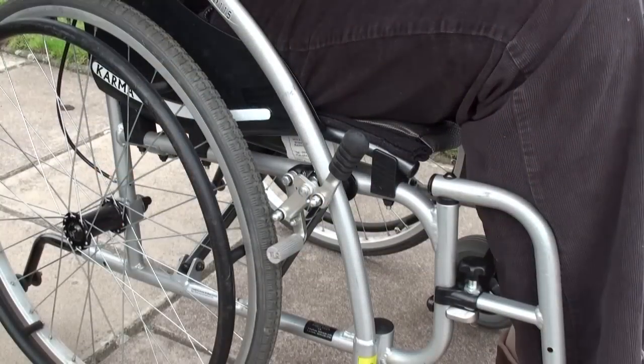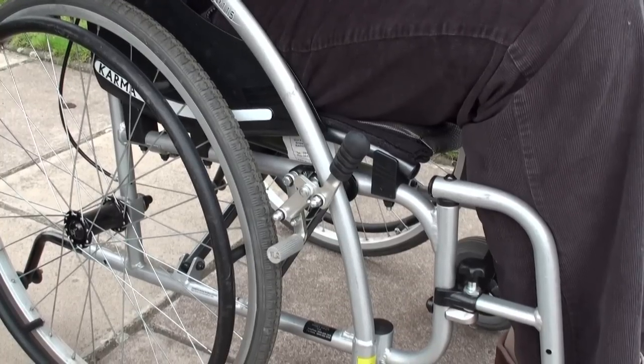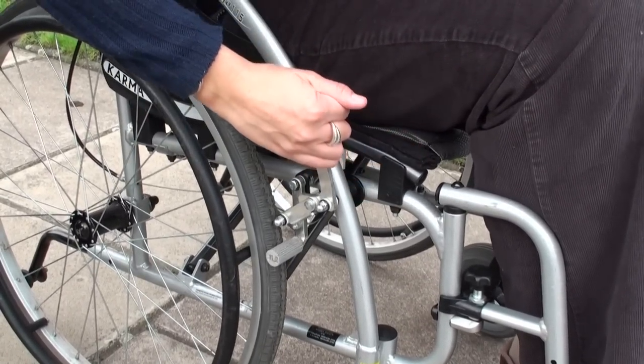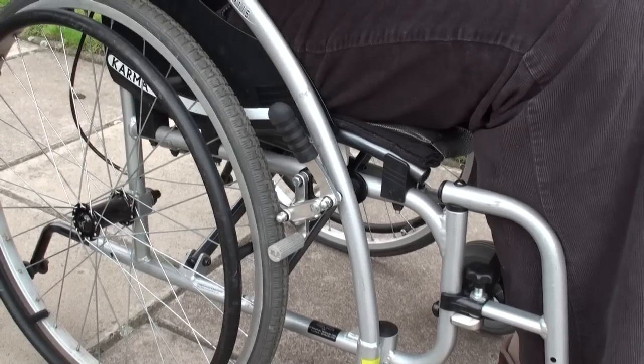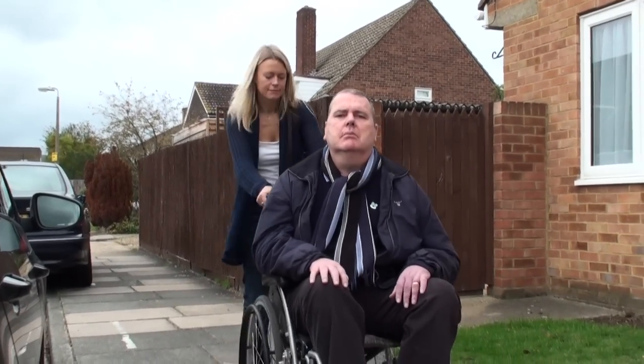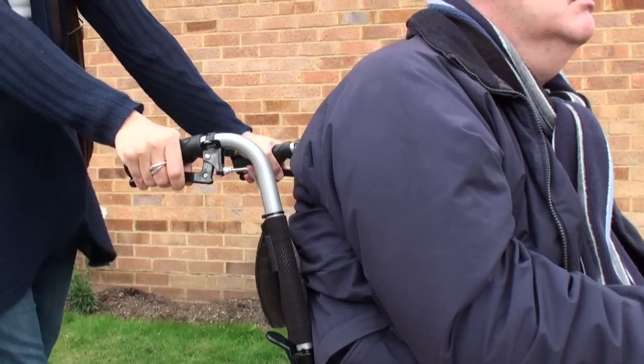All wheelchairs have brakes installed on the wheels. Ensure these are applied when you are stationary, especially when travelling on a bus or in a taxi. As Neil is heavier than myself, I ensure the wheelchair we ordered came with handle brakes. These give me extra control when slowing the wheelchair down and up slopes.